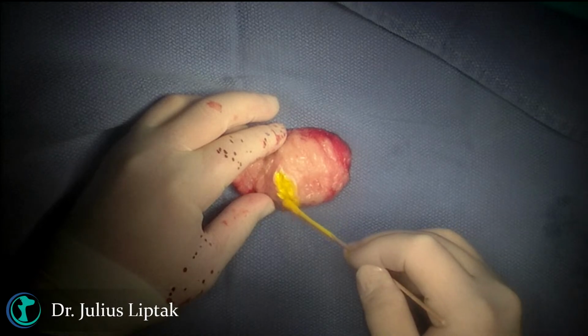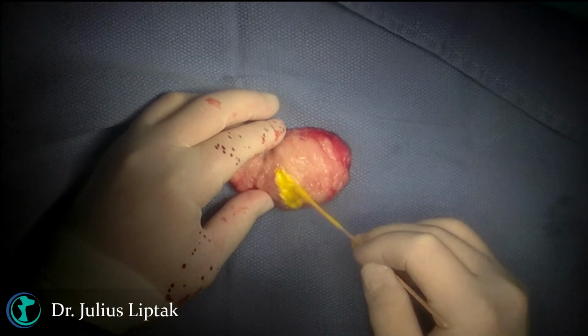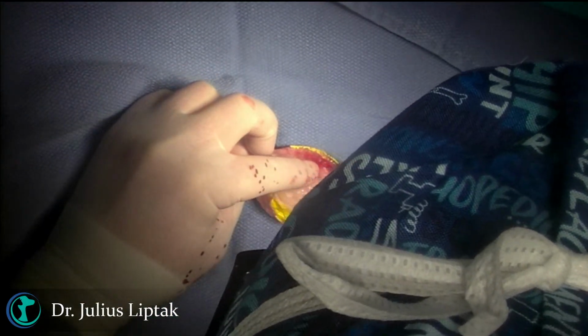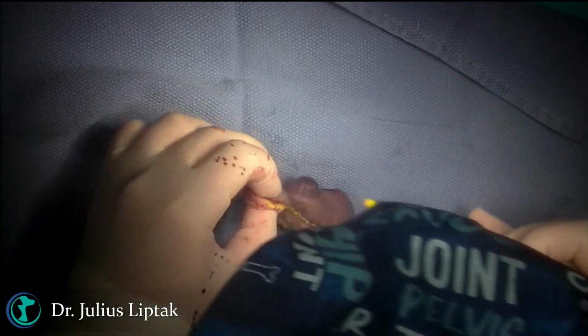We're trying to stop any of the ink going into the subcutaneous tissue because it can work through the planes. And then laterally, it's going to paint the edge of the skin, just skin, not the SQ, in this case because the tumours are arising from the skin. It depends on the type of tumor. If it was arising from the subcute, I'd be marking the subcute margins.